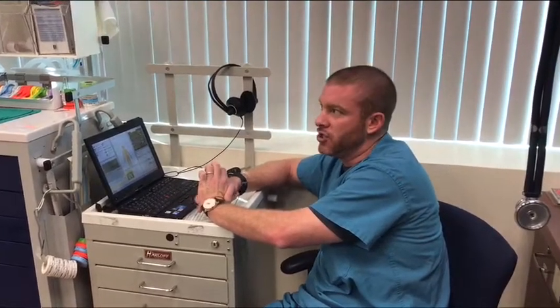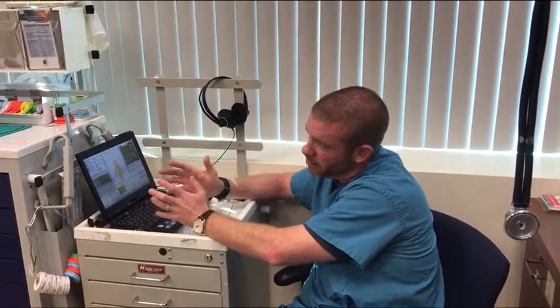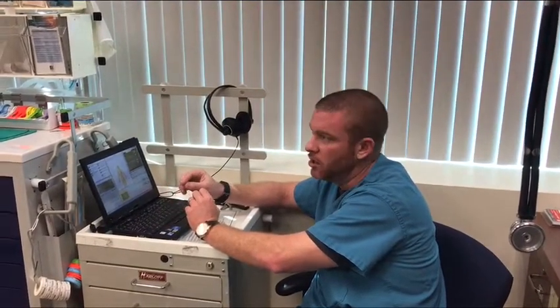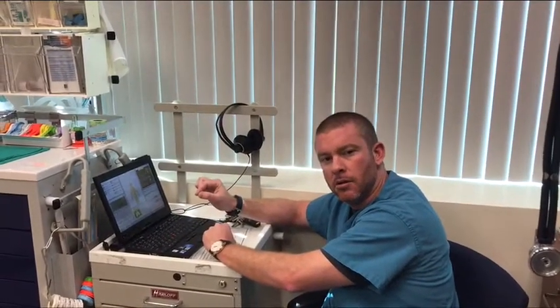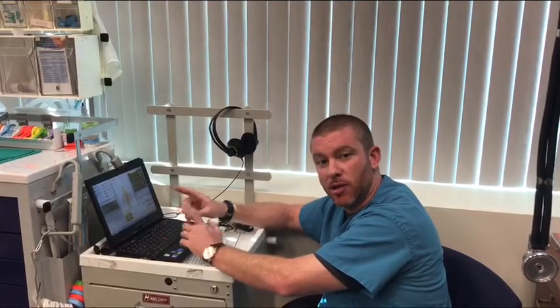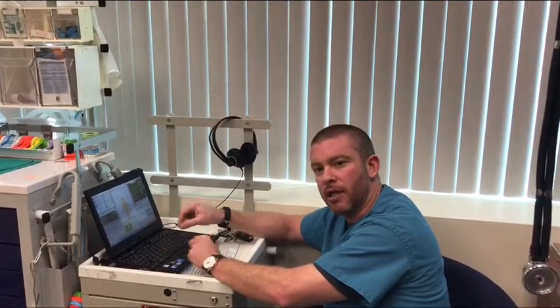But we're not sure if the patient is breathing. You hear an alarm in the background going off, and you look at the alarm and analyze what it says. What does the alarm tell you is going on? The end-tidal CO2 is low. It has been low. Why is it low? Because we've been overventilating the patient to blow off the gas. So do we think the patient's going to spontaneously ventilate with a low carbon dioxide level?